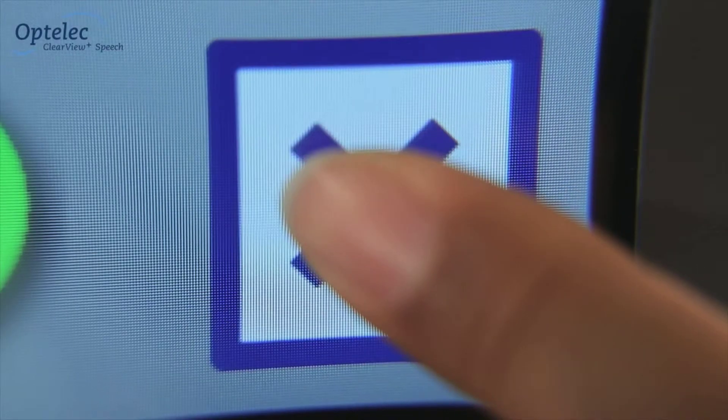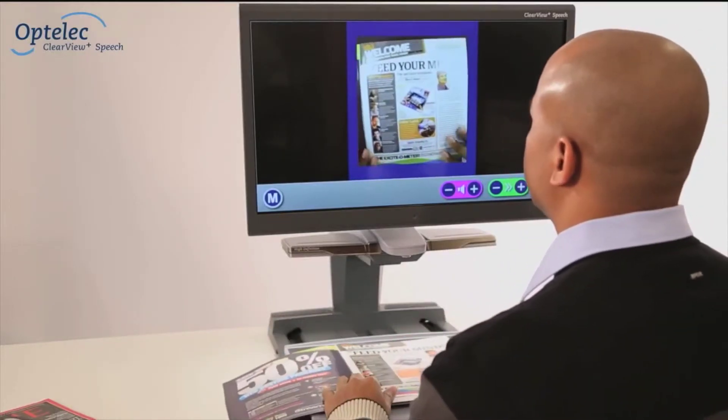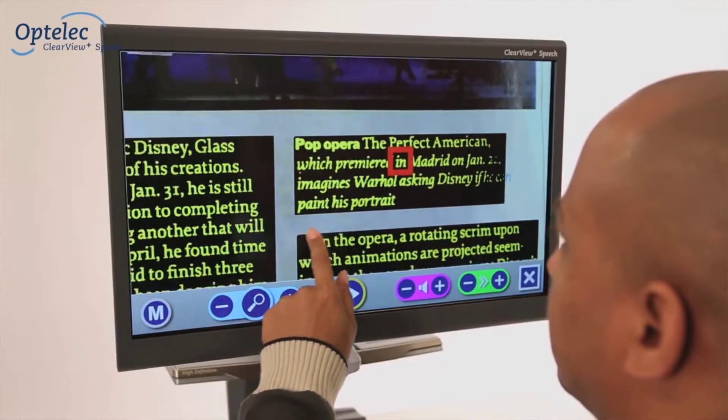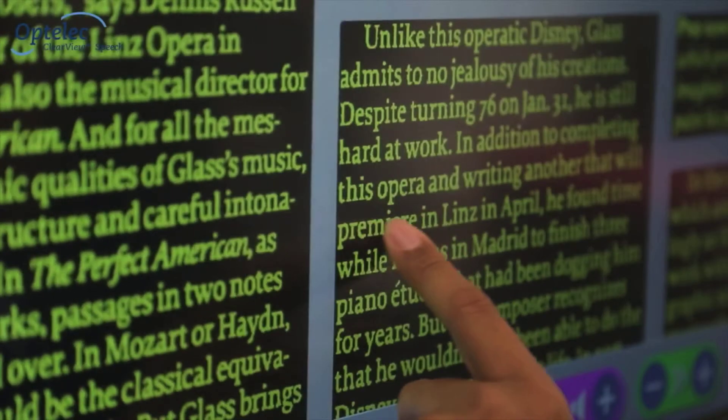Do you want to listen to another document? Simply press and hold the X button. Place a new document onto the reading table and tap the screen once again. Enjoy instant point-and-read navigation through your document — all you have to do is swipe your finger across the screen.